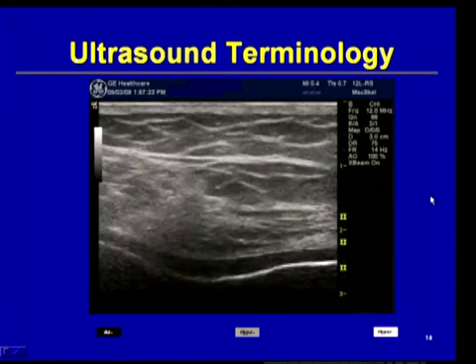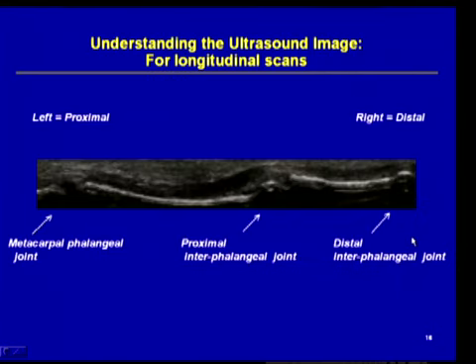Another example of that is looking at the articular cartilage of the knee. Here we see the femoral condyles and a very nice structure showing the articular cartilage representing the bone. Other structures that you can see here are the muscles and the tendons around those and some of the perimuscular sheaths. And I'll show you some more clinical illustration of those as we move through the video.